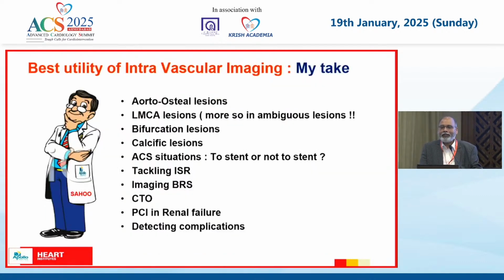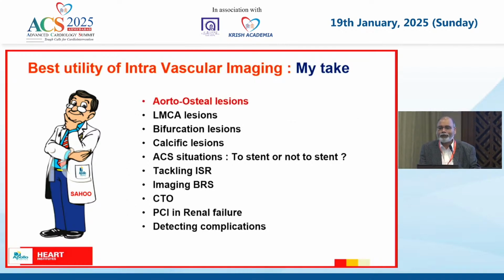That's the whole thing. Now, my take about all these things will be on these subsets: ostial lesions, LMCA, bifurcation, calcific, ACS, tackling ISR, BRS, CTO, renal failure. All these subsets have been dealt with. I'll quickly go through some examples.